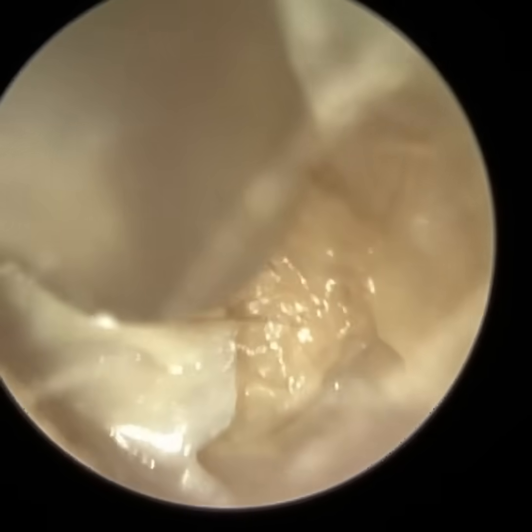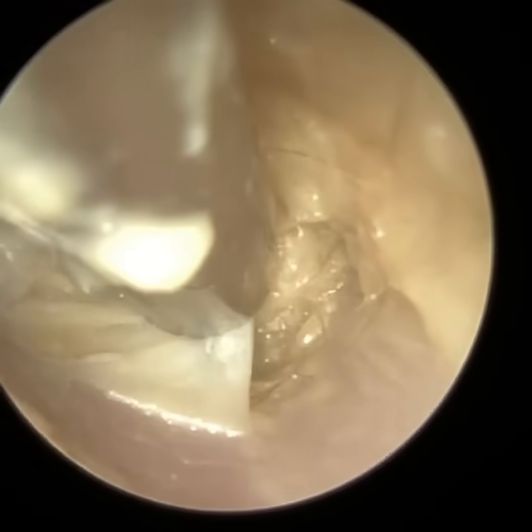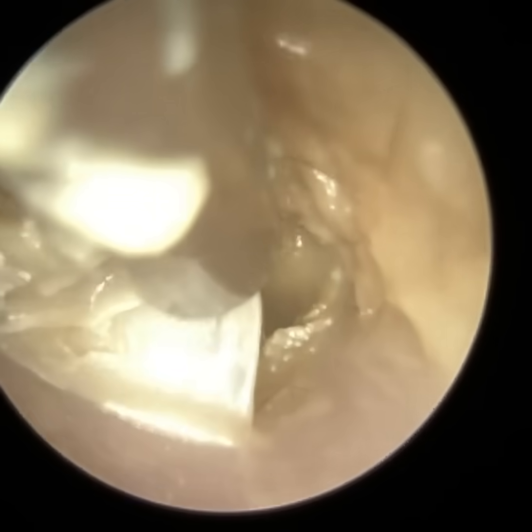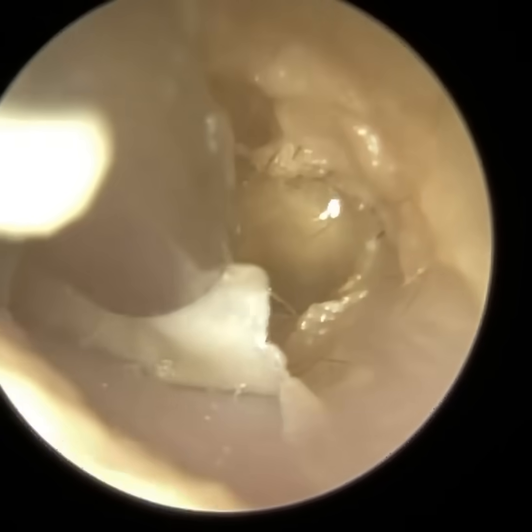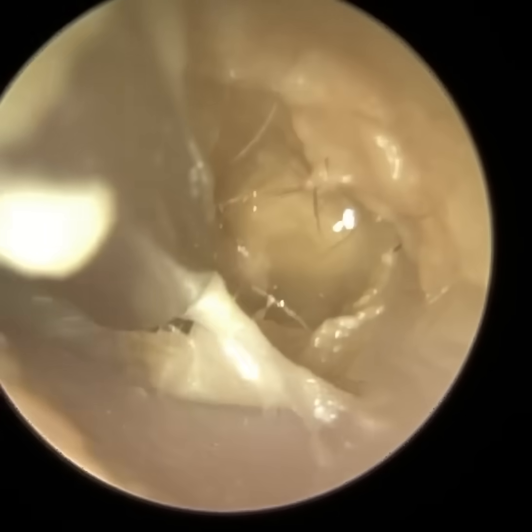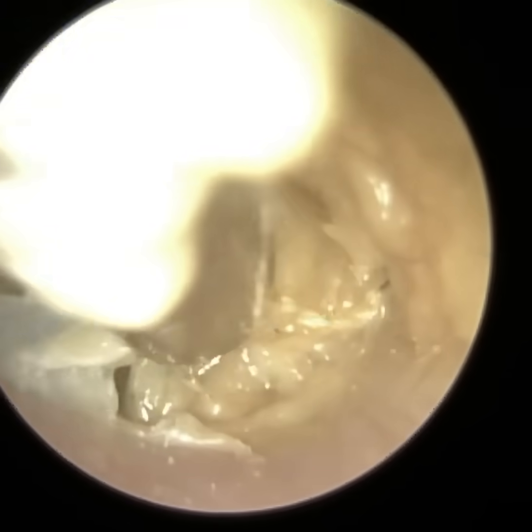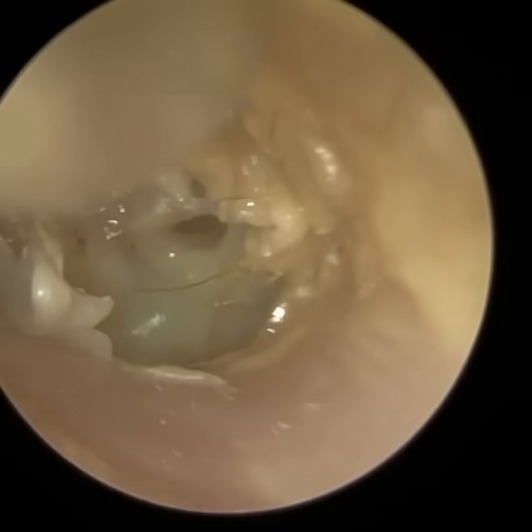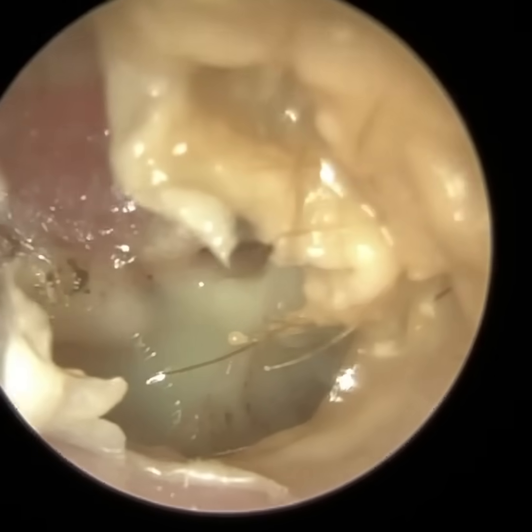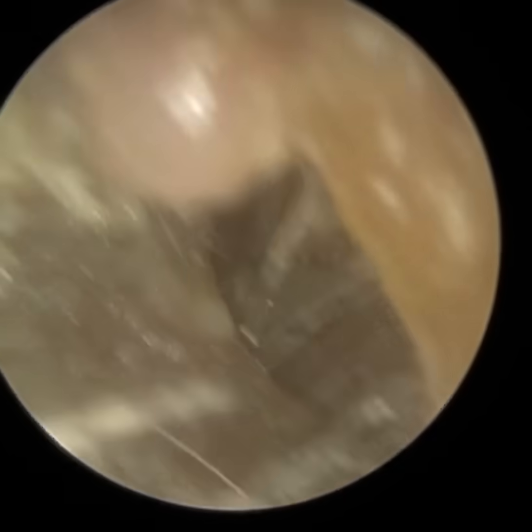what was interesting with this case is that once I removed this debris, and we know it's a fungal infection because you'll see some spores in a moment on the eardrum itself, but she had an underlying perforation, so a hole in the eardrum, and we don't know the exact cause, but it could be that she's got what we call a mycotic thrombosis of the eardrums, so basically a blood clot caused by the fungus, which has then deprived the eardrum of the necessary blood supply, which has then caused it to perforate. You'll see it posteriorly, you'll see it about 3 o'clock.